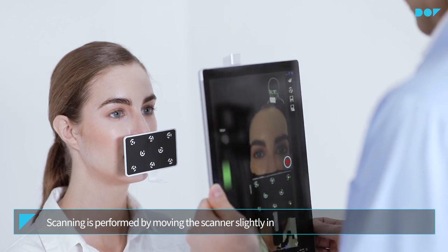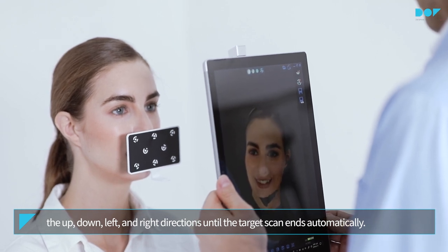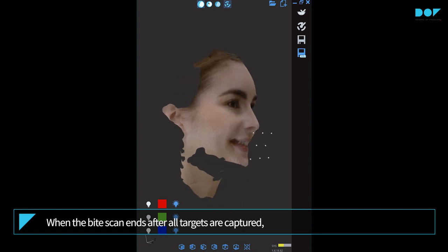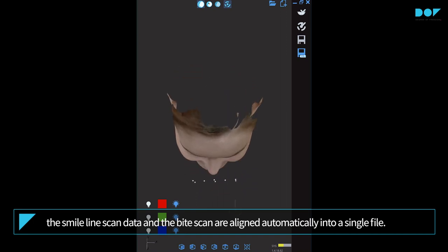Scanning is performed by moving the scanner slightly in the up, down, left, and right directions until the target scan ends automatically. When the bite scan ends, after all targets are captured, the smile line scan data and the bite scan are aligned automatically into a single file.